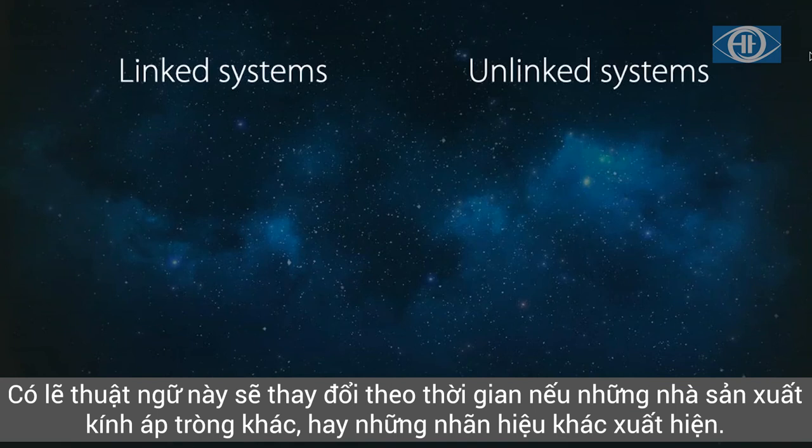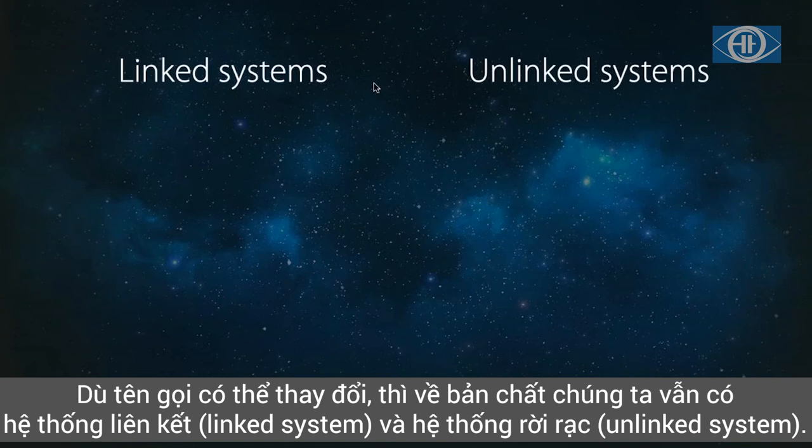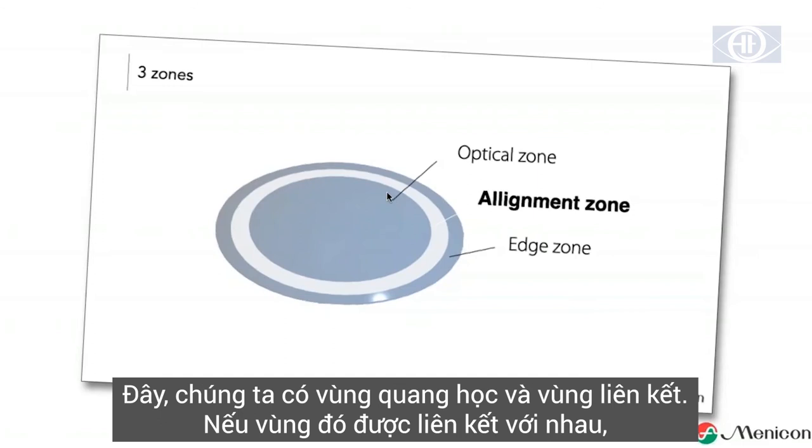Maybe this terminology will change over time, because if other manufacturers or brands come up, or scientists say this is something we have to embrace, and they already do in the Netherlands by the way, the names may change over time. But again, we have linked systems and unlinked systems, and this is very crucial to understand. What do I mean exactly with a linked system? Let me go back to the previous slide: we have the optical zone and we have the alignment zone.